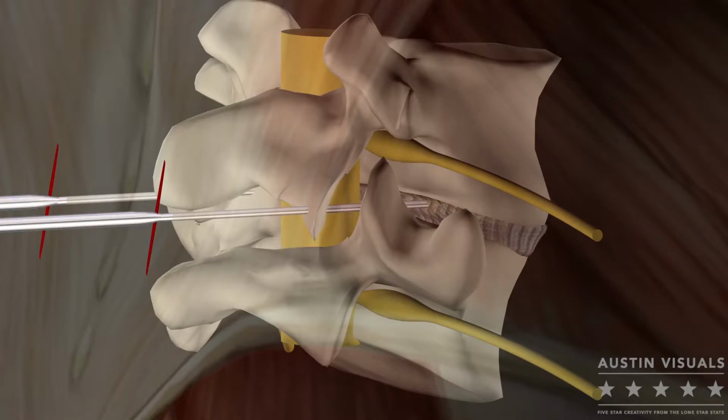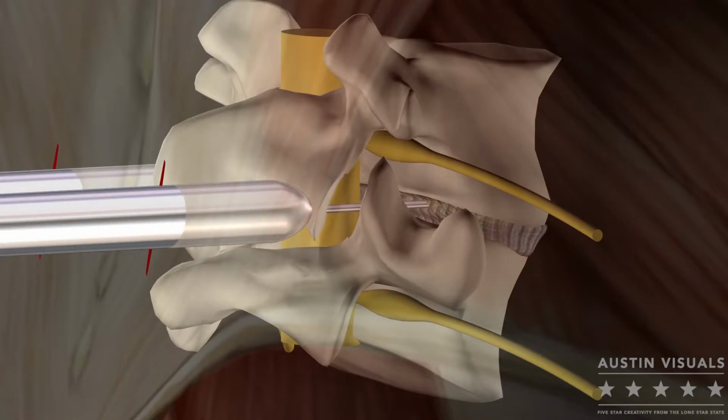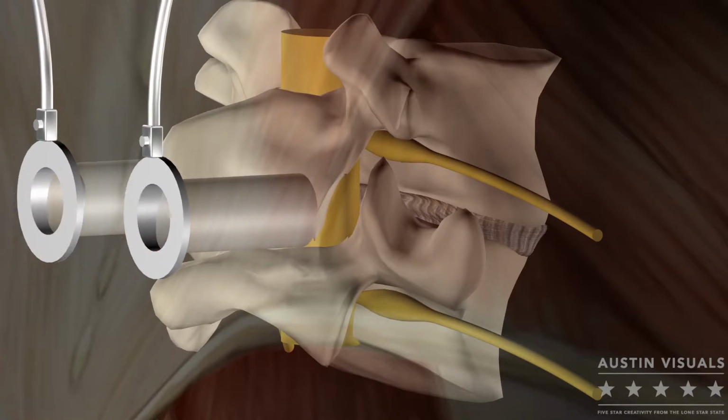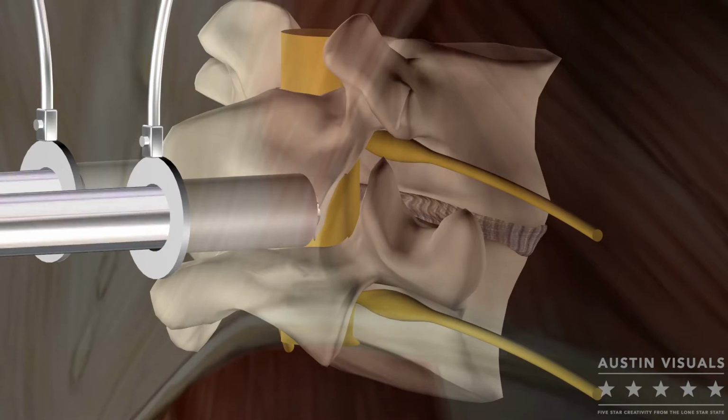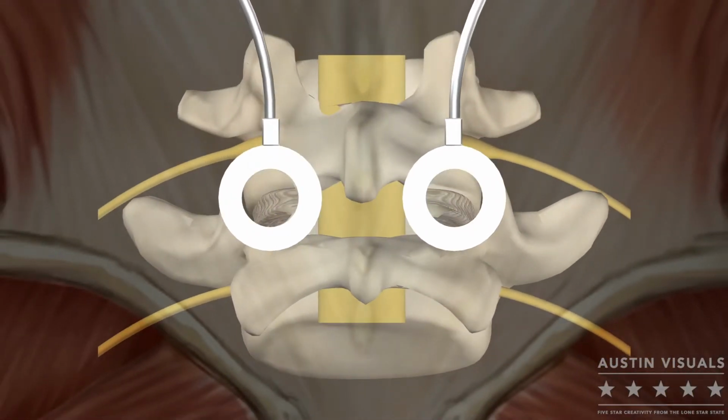Then, percutaneous dilation of the posterior soft tissues is carried out, and the final soft tissue dilator is locked onto the facet joints bilaterally, perpendicular to the spine. Ultrasonic bone removal and aspiration of an 8 to 12 mm cylindrical pathway in the facet joint occurs into the lower foramen. Alternatively, a perforator drill bit can be used to create the cylindrical pathway.